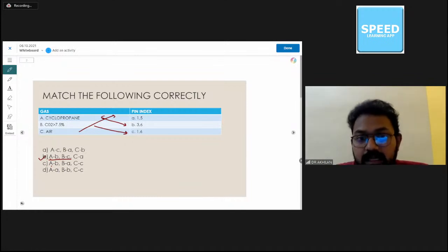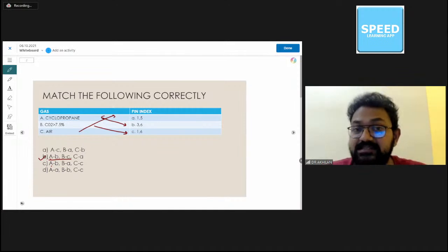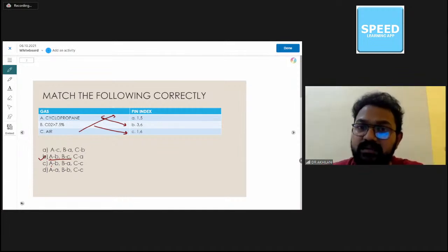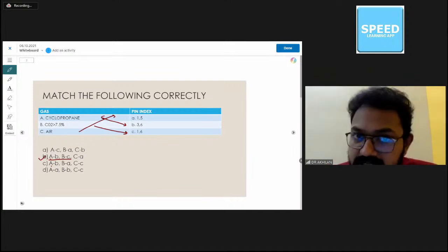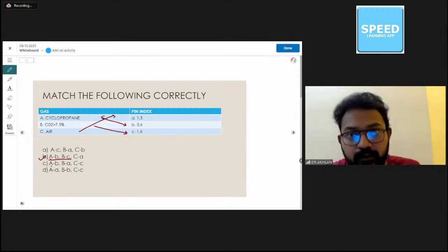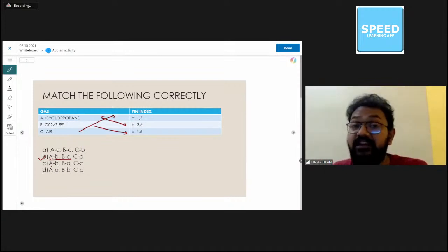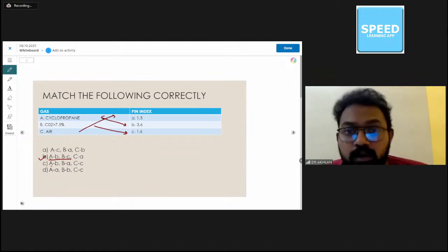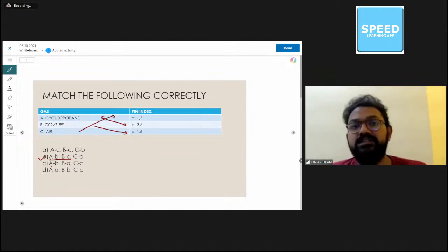I hope you have got a very good basis in anesthesia cylinders. We have discussed the high pressure system already. Tomorrow onwards, I'll be discussing some factual questions which might come from the intermediate pressure system and low pressure system. Thus, I have covered a whole chapter for your entrance exam. It is a very, very difficult chapter, which is called the anesthesia machine. So I'll come again tomorrow with a new question on intermediate pressure system.